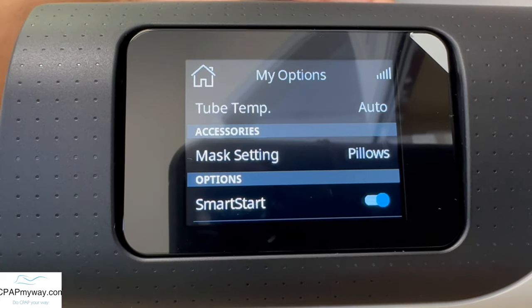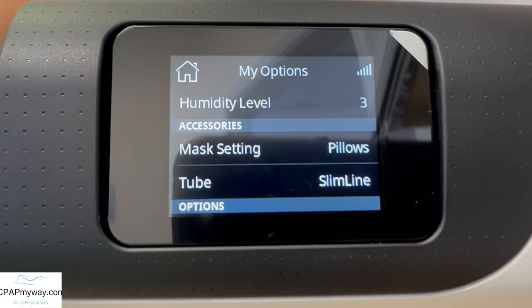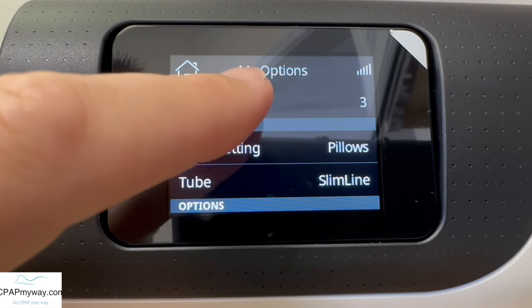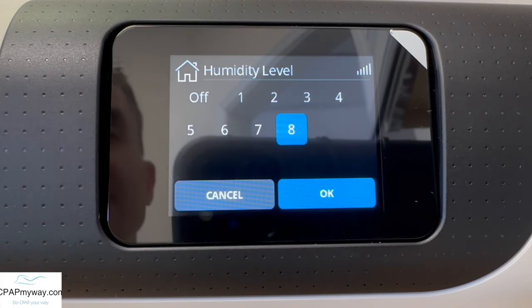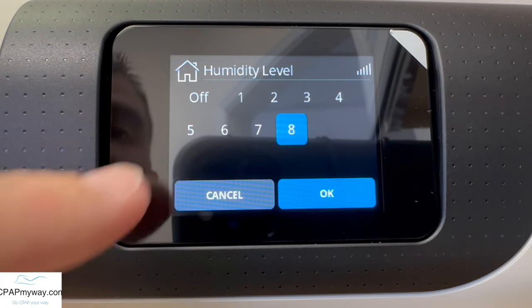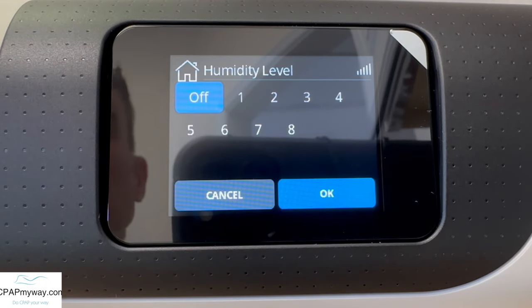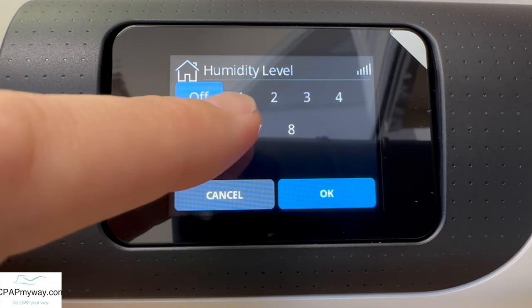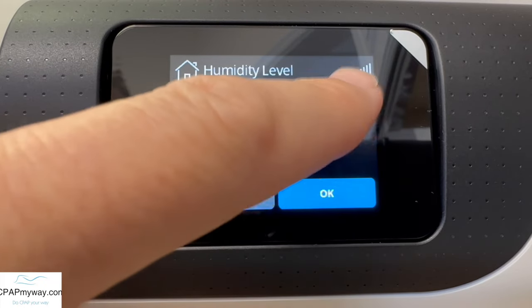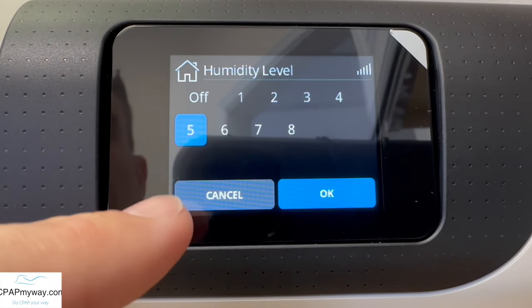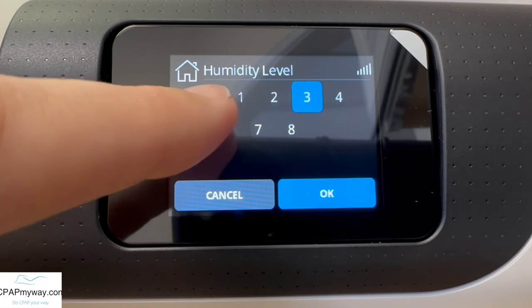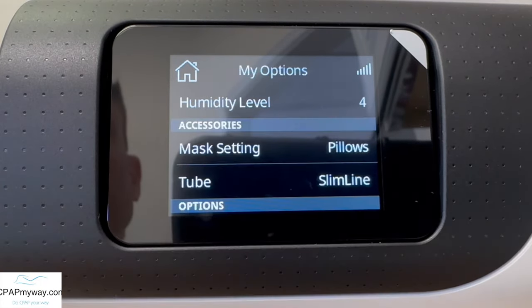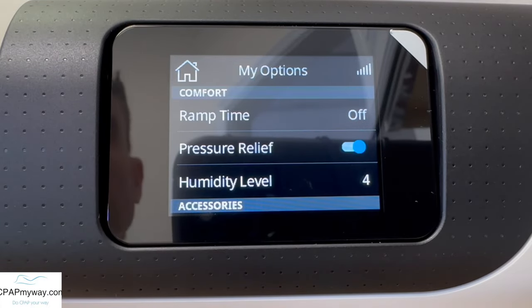If we remove the climate tube, you go back to just a standard humidity level, and you can go as low as off or as high as eight. If you're running it without water in the chamber, turn it off. Or if you just want cool pass-over with the least amount of humidity, leave it off. If you're experiencing dryness, turn it up a notch. If you're experiencing excess condensation, go down a notch. Most people do pretty well between four and five — it's a good place to be.